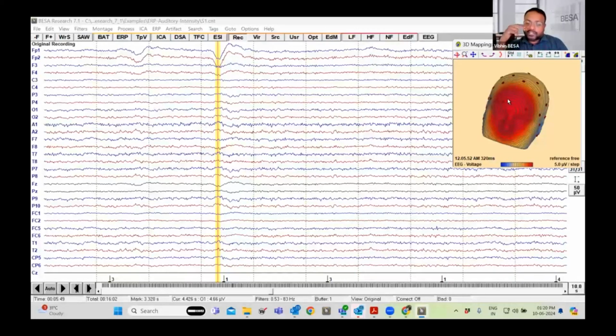So when we close the eyes, the eyeball just rotates backwards, and that is causing these frontal electrodes to be relatively more positive than the other regions. In electrophysiology, positivity means going downwards. It is the opposite of the other convention, where positive is up and negative is down. With electrophysiology, normally the positive graph is downwards and the negative graph goes upwards. That is why you see a downward deflection, which indicates the eyes have been closed, during which the eyeball, the cornea, has moved up, causing the frontal electrodes to have a positive polarity.